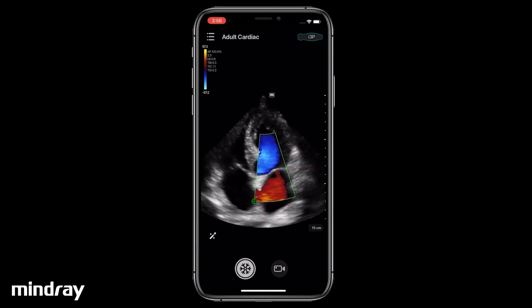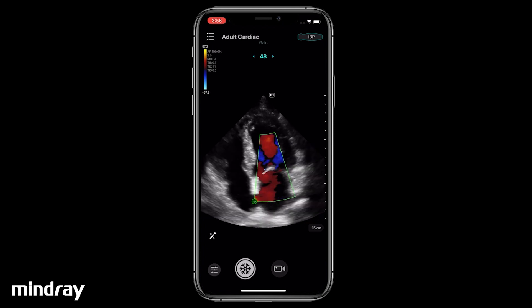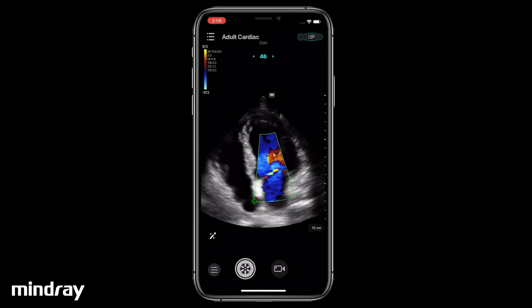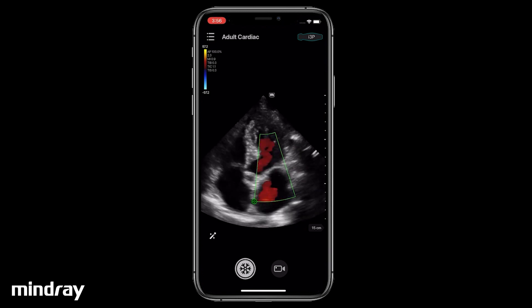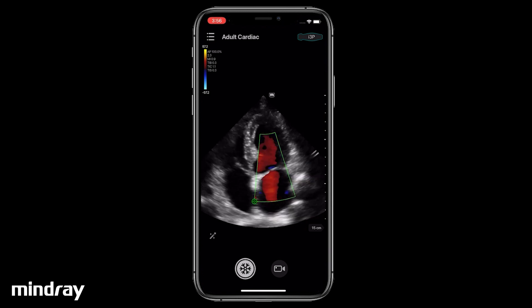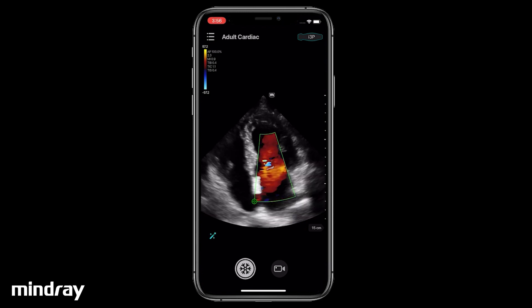Swipe left and right to change the color gain. Tap the iTouch icon for automatic image optimization if you are unsatisfied with the manual adjustment.